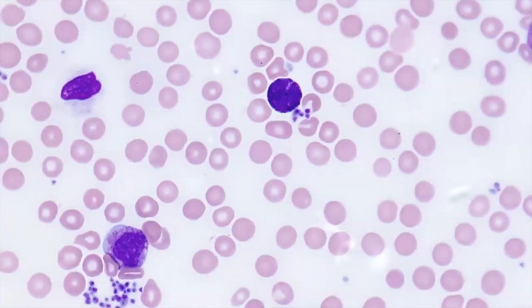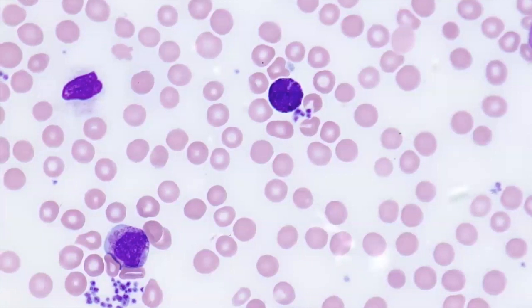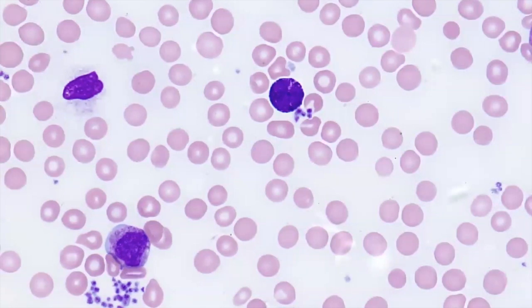Basophilia is commonly associated with chronic myeloproliferative disorders. In particular, chronic myeloid leukemia should be first on the diagnostic list. Basophilia may also be seen in reactive conditions such as allergic disorders, hypersensitivity reaction, influenza, smallpox, chickenpox, rheumatoid arthritis, ulcerative colitis, chronic renal disease, and following radiation. Elevated white cell count with a basophilia is a common finding in the chronic phase of CML.